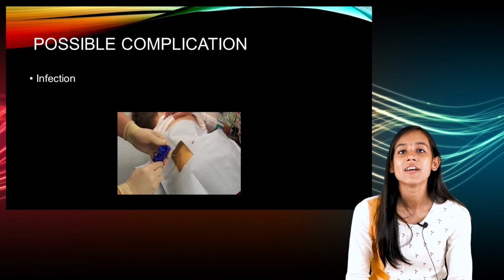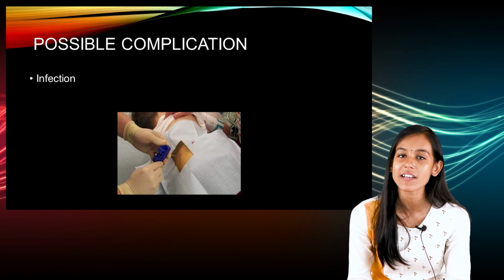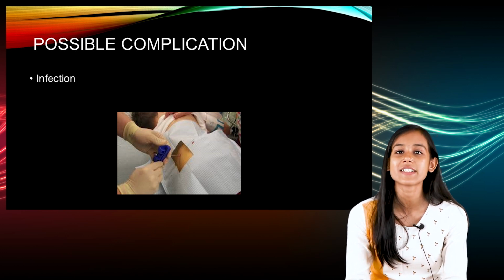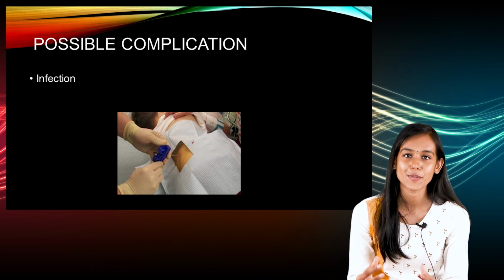Now the next thing is the complications of this procedure. As we are saying, this is an invasive procedure, and we are going to insert the needle into the bone marrow, so there are some risks and complications involved. Next we are going to see the possible complications that might occur during or after this procedure.